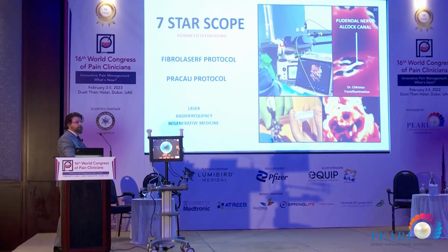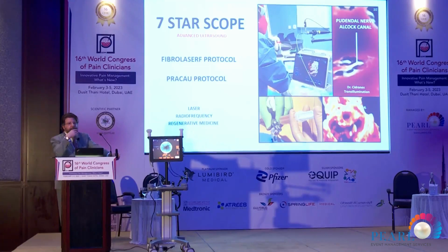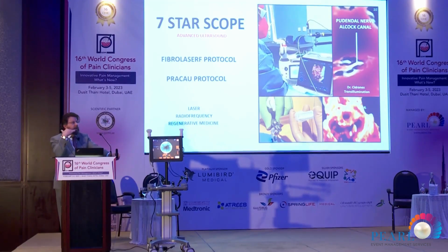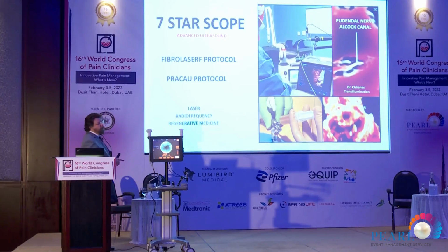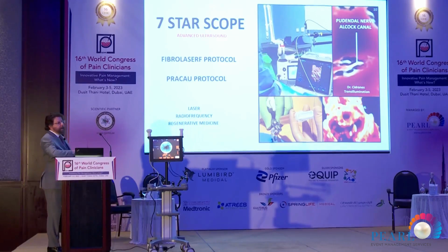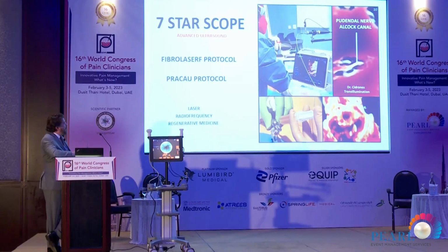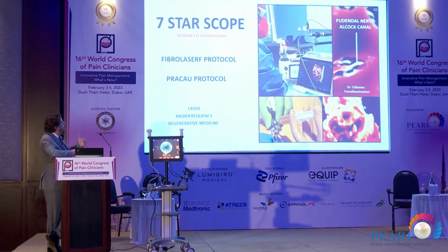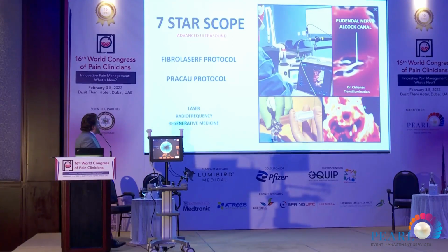And this is good when you compare the electrophysiological study before and after the treatment. It's good when you have a denervation, or maybe a loss of velocity around the nerve in this process. I'm working every day with my neurophysiologist, and they showed me this report, and I am very happy with this.